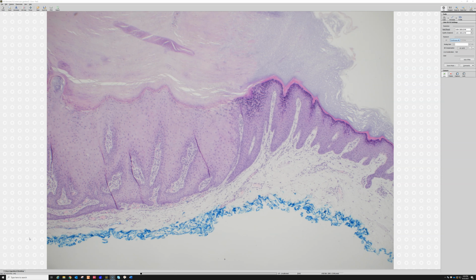So I understand the hesitancy to do a deeper biopsy, but I will say, especially when it's an older sun-damaged person and there's a concern for squamous cell carcinoma clinically, if you can get a deep enough shave to ideally get underneath the whole epidermis, underneath the lesion, that's going to make it much easier for me to give a definitive answer that this is verruca without hedging and saying I'm not sure, and I can't exclude this and that.